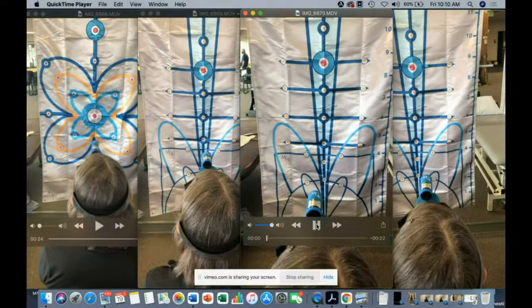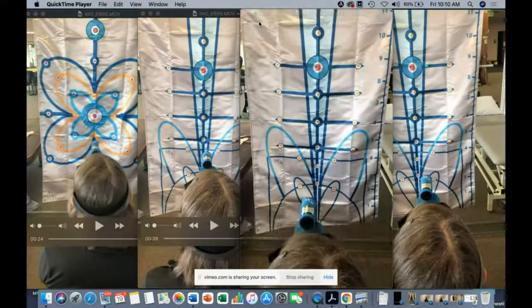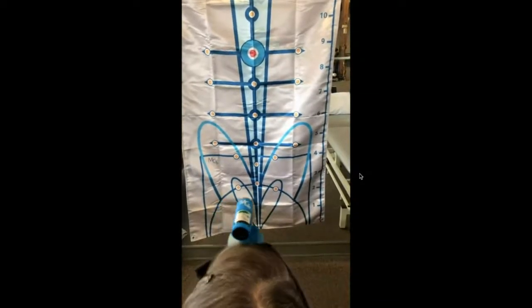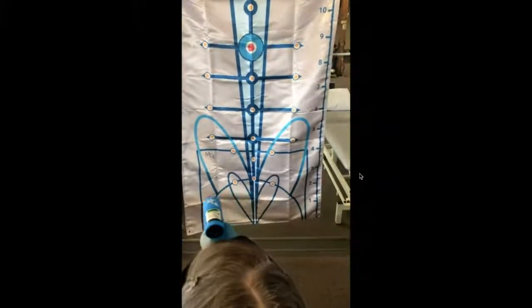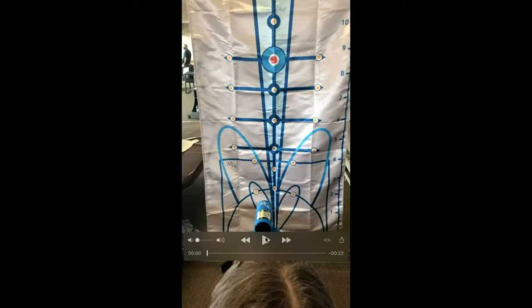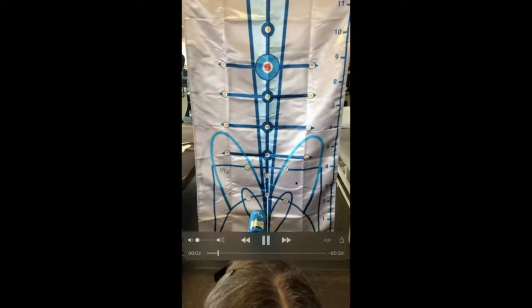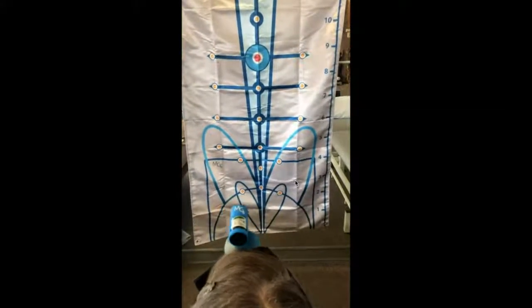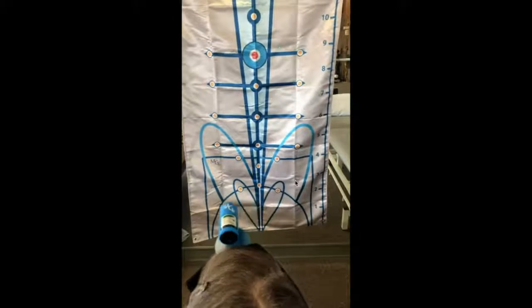And as we keep going through practice runs, let me get this bigger. Sorry, there we go. I need to remind her, hey, don't look directly at the laser. You're going to be looking at a bottom line, but let's try to go back and forth at a faster cadence now and see if we can get closer to 1 hertz, which is our standardization for doing the VOR, going side to side. And now she's really trying to increase her speed and keep equidistance, and she just does not like it, but she's definitely learning that she has to go to that right side.